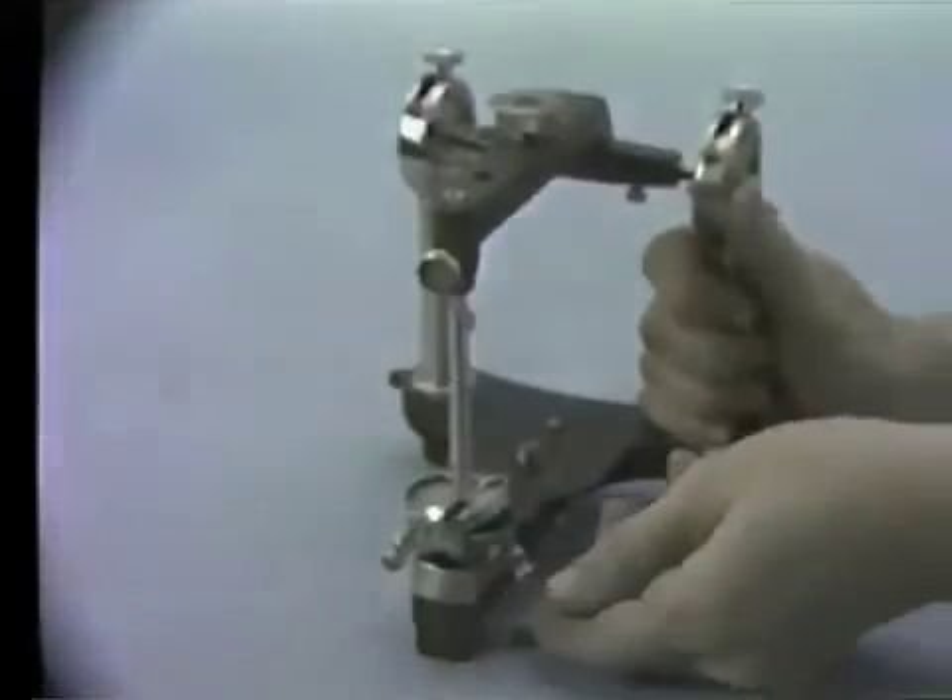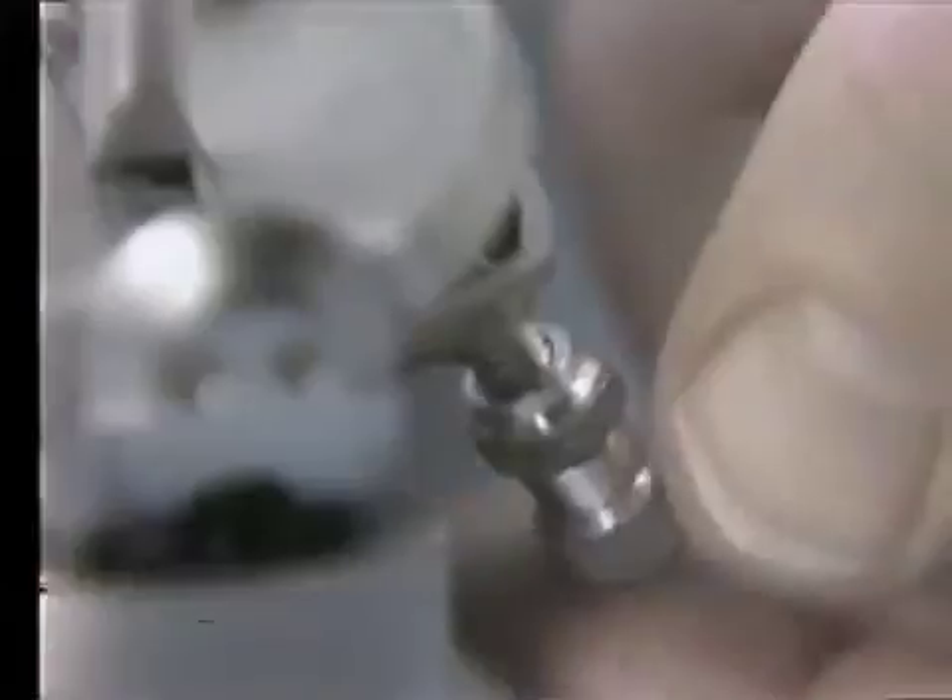Reduce the elevating screw of the lateral wings until they are at their zero setting. Lock the thumb nut found on the elevating screw.